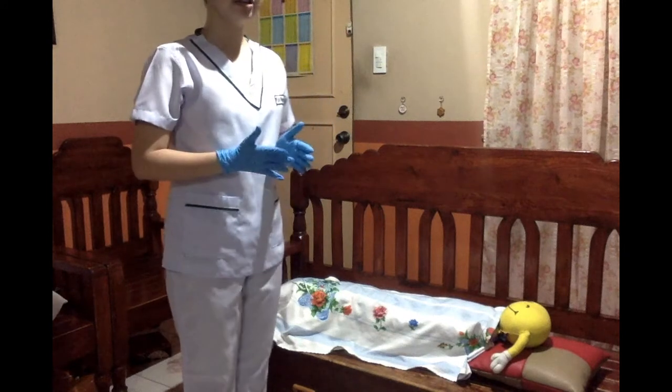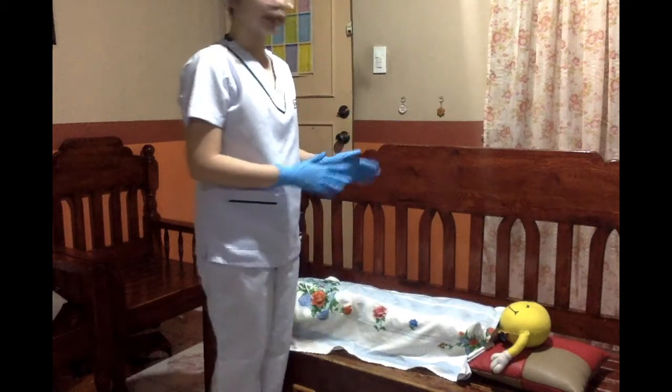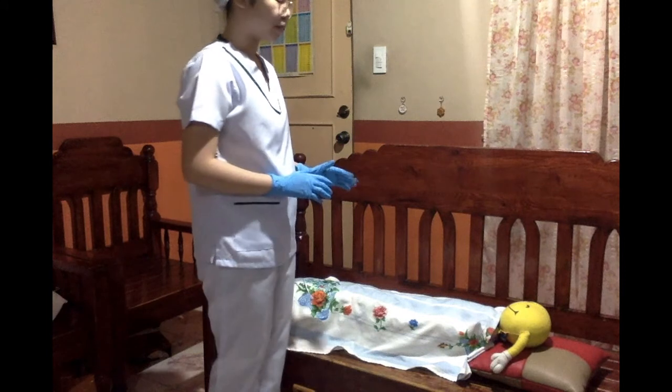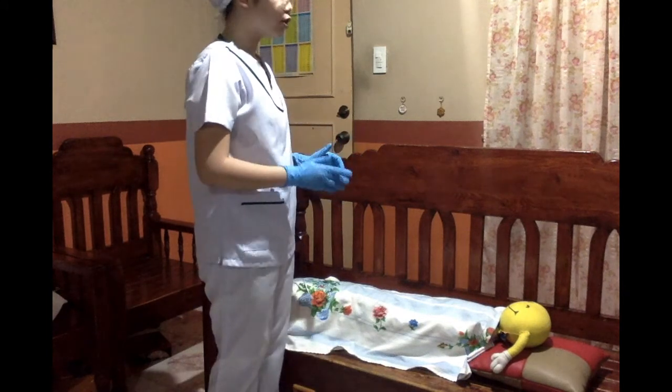After donning non-sterile gloves, I will now lower the side rails and assist the patient in a supine position. This will facilitate comfort and access to the urethra. Then I will also place a linen saver under her buttocks to avoid soiling the linens.